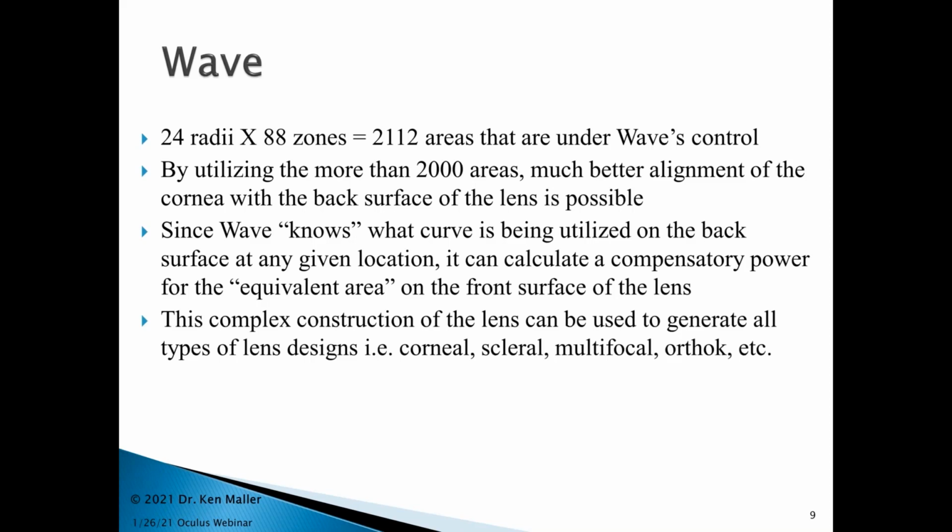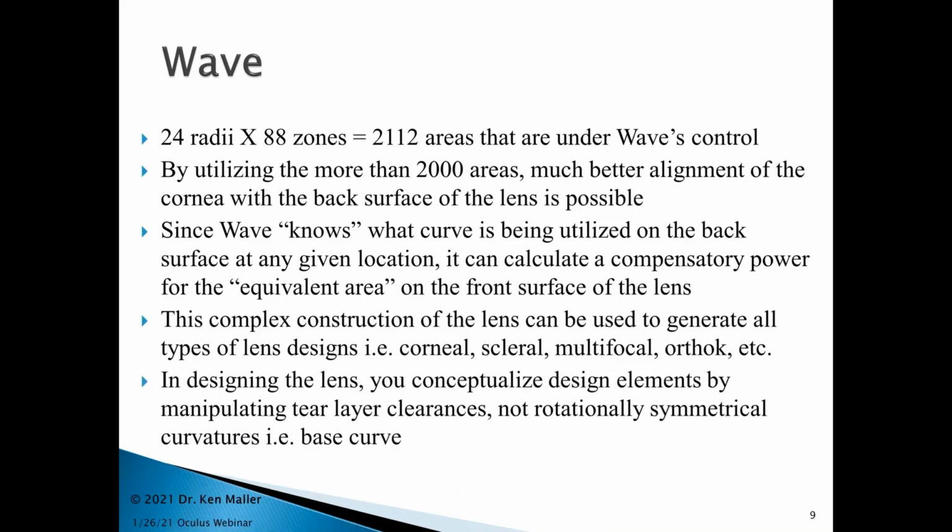The complex construction can be used to design basically everything: corneal, scleral, multifocals, orthokeratology. And when you design these lenses, you really don't think in terms of base curves that are rotationally symmetrical, but rather you think more in terms of tear layer clearances between the front surface of the cornea and the back surface of the lens over any given area.